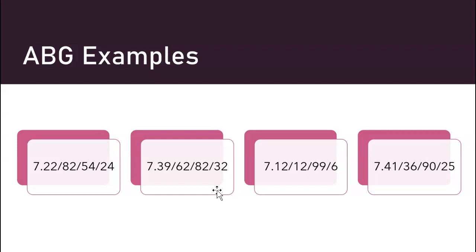This patient could be COPD, they could even be a COVID long hauler, they could even be a sleep apnea patient, certainly with really extreme sleep apnea. They could be a whole bunch of different things. Extremely bad asthma, smoking, anything like that. Then we'll look at the oxygenation, and oxygen is ideal for whatever mode they're on. So this would be a fully compensated respiratory acidosis.